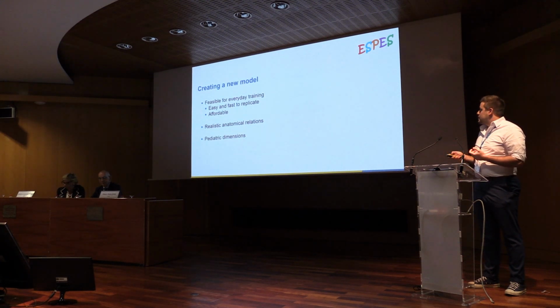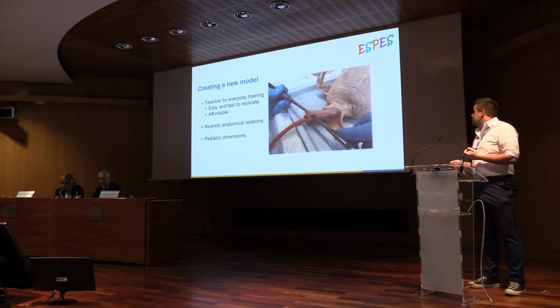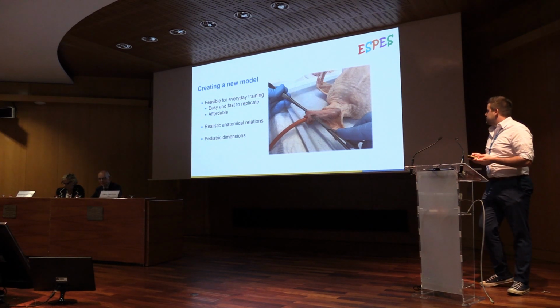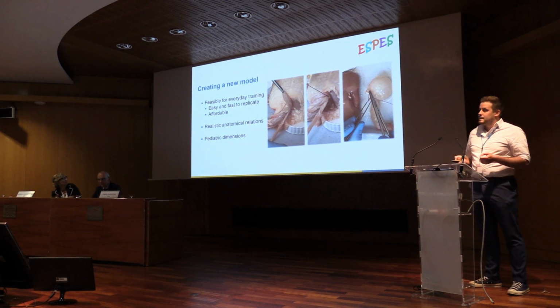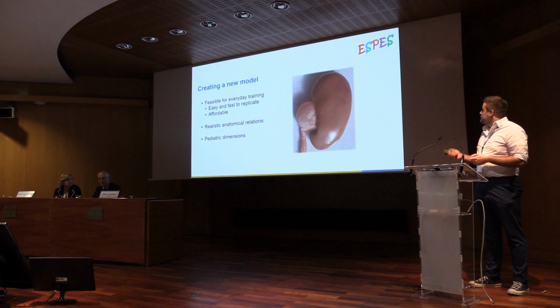That's why we connected a chicken crop to a piglet's kidney, and that's shown in the next few pictures. First of all, the identification of the esophagus, identification of the crop, ligation, resection, and fixation of the crop to the piglet's kidney. And after approximately 10 minutes of preparation, you'll get the end result.